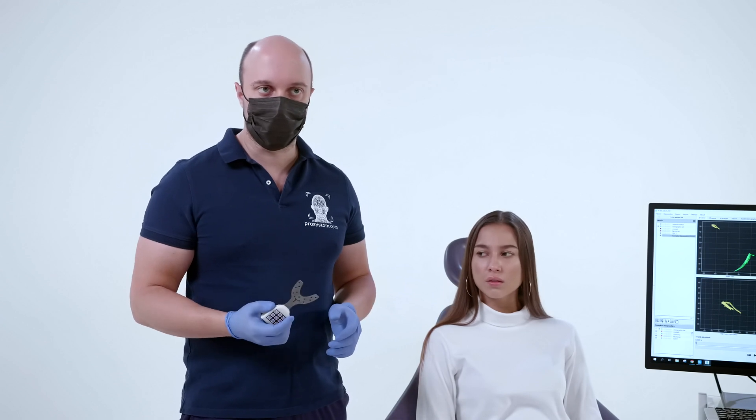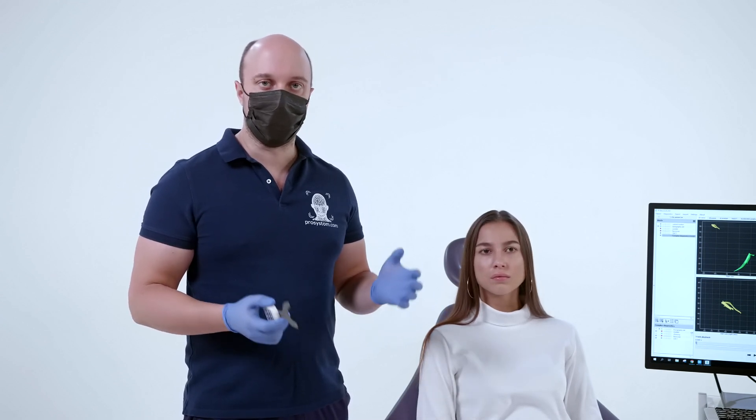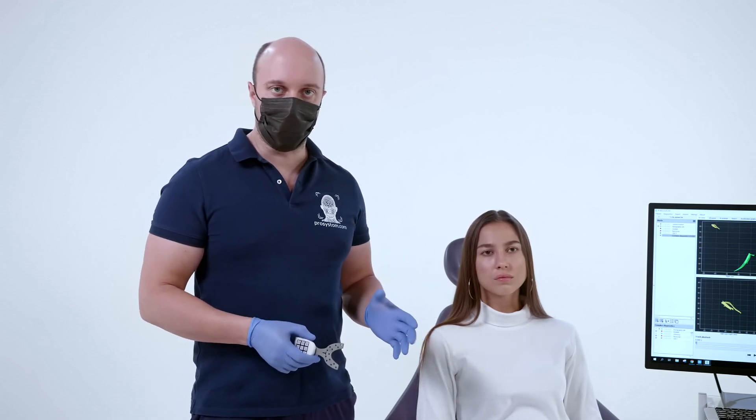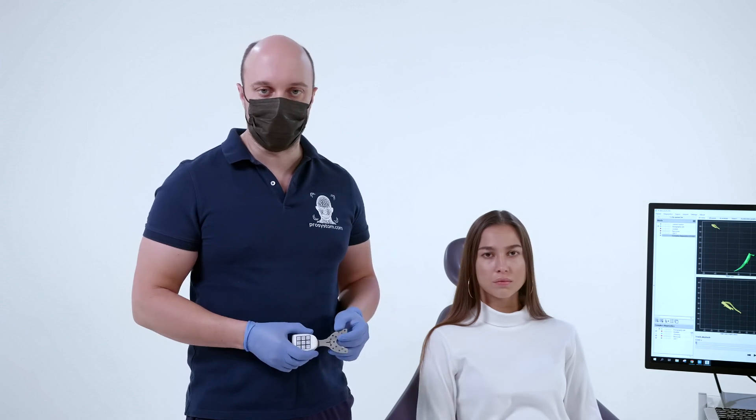The first stage during the registration of movements of the lower jaw — we use a digital arc. The digital arc is necessary in order to register data in the clinic and transfer them to the program and then to the laboratory.